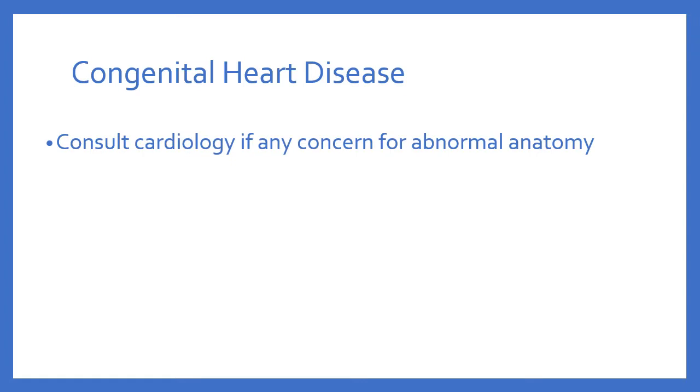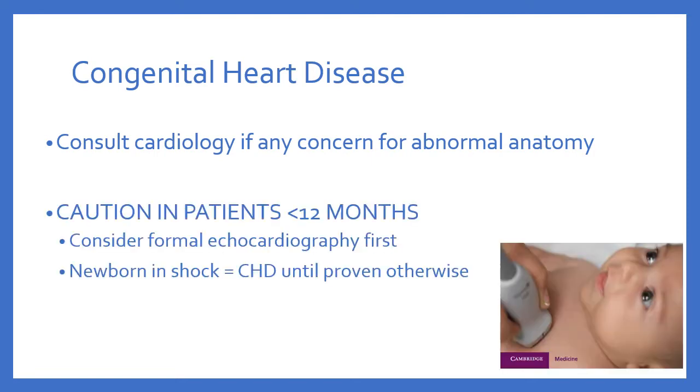First of all, if you are concerned about any abnormal anatomy, it's important that you consult cardiology and that you take any of your images with a grain of salt. And especially if our patients are less than 12 months of age, we have to be very careful. So really, before using FOCUS, you may even consider getting a formal echocardiography to make sure that there's no abnormal anatomy. And if you have a newborn who's in shock, then you have to suspect congenital heart disease until you prove otherwise. So especially in these patients, we really need a formal echo.